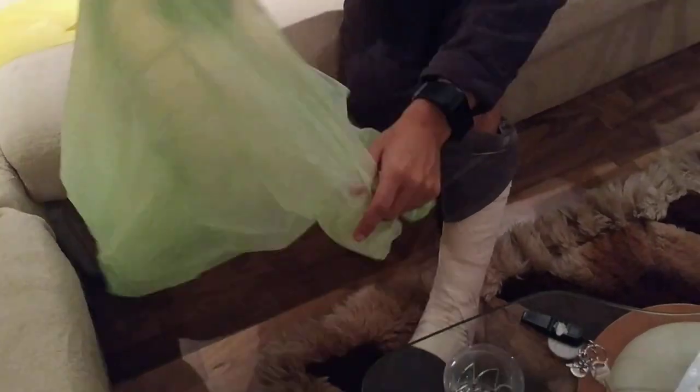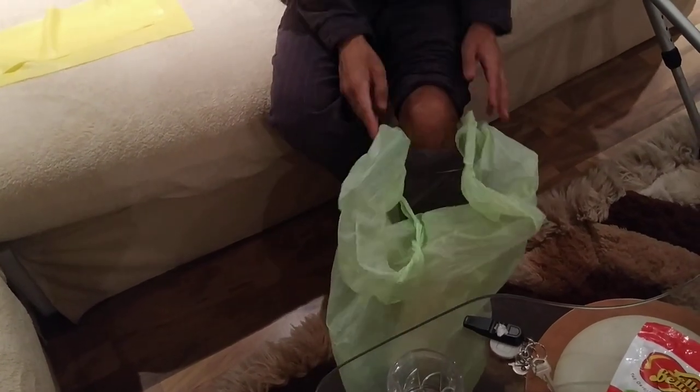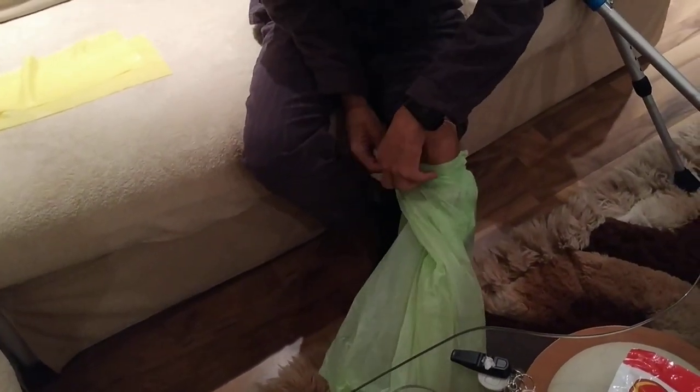Then we take the plastic bag and push it in over the cast. The most problematic area to worry about is on top, because that's where all the water will come in, especially if you're showering, so we wrap this around and put it in there.